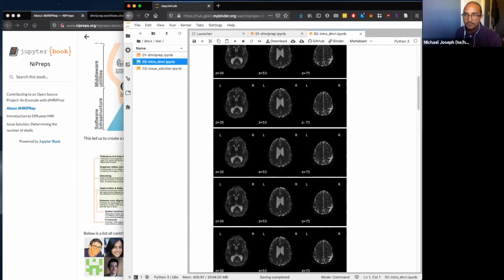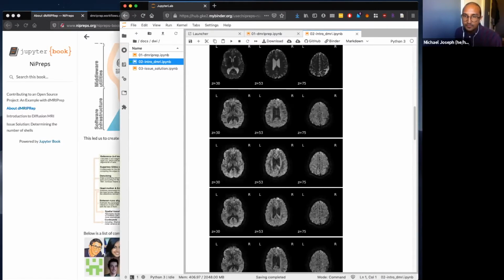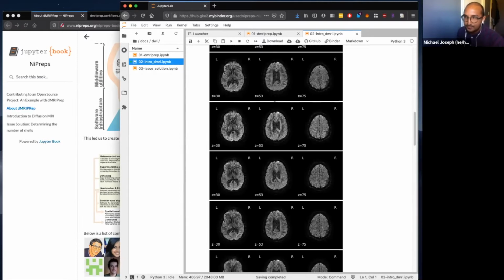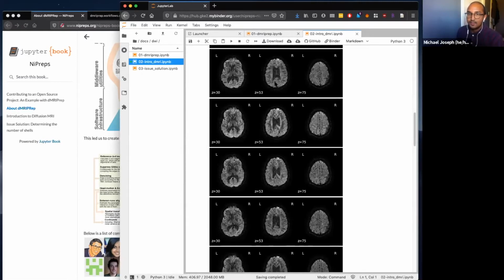for our first volumes, we don't apply any magnetic field gradient. But then in our next 5, we apply a magnetic field gradient in different orientations. And each orientation captures the preference of water molecules diffusing in that direction. So how this looks is it shows as signal loss.